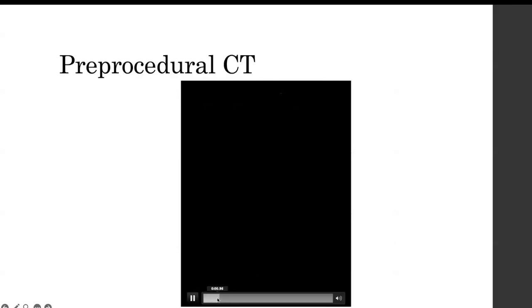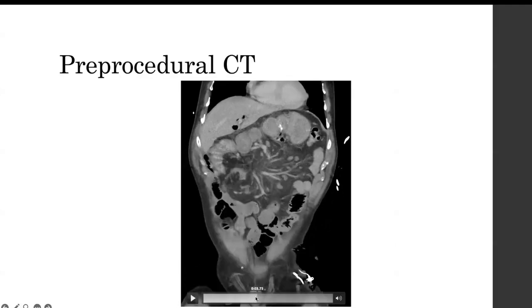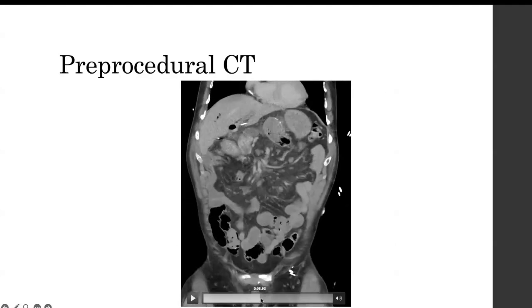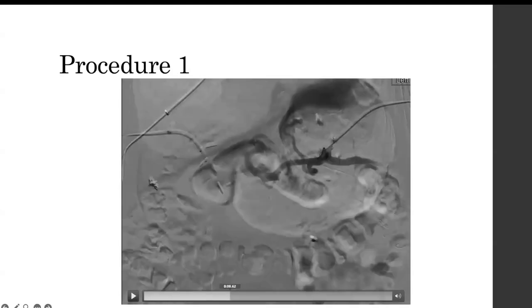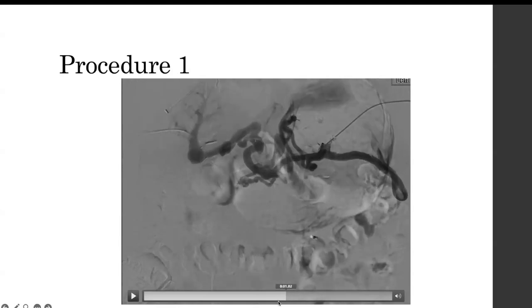And this is another view of it, hopefully. Yeah. So again, you can see this portal vein. You see all these mesenteric vessels going into nothing. So it's a mess. So it's one of those times you may have to say, "Hey, I don't have anything to offer." What we did here though is like, all right, I can try. I can put a TIPS in. Maybe that will help. I don't think it will, but we have no other option.